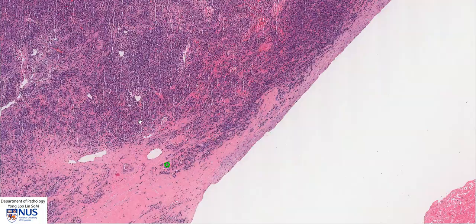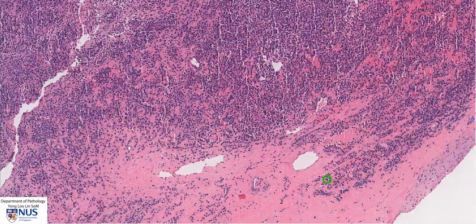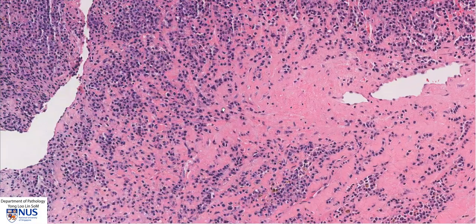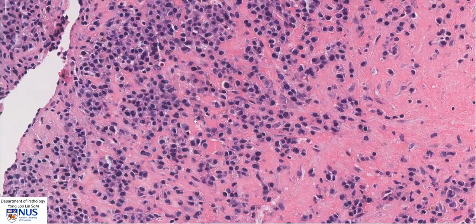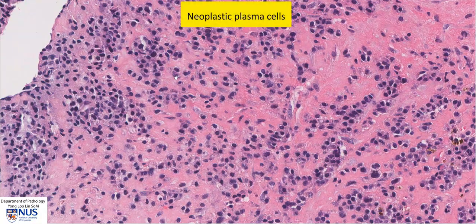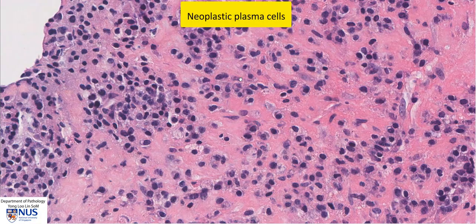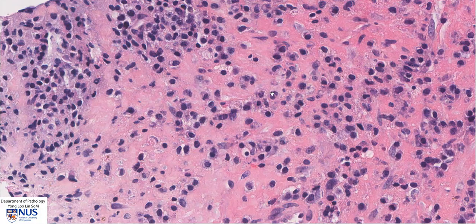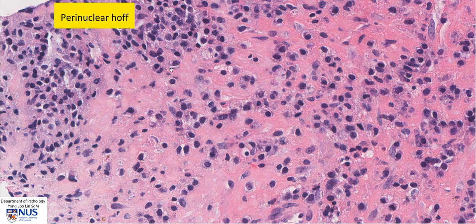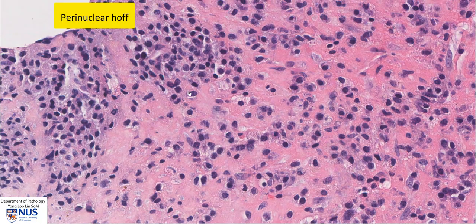Let's have a look at the bluer neoplastic areas. We can actually see that there are numerous neoplastic plasma cells. We can still recognize these cells as being plasmacytic in nature because we can still see that the nucleus is eccentric. There is still a little pale perinuclear hof just next to the nucleus, and this is the outline of the cell.